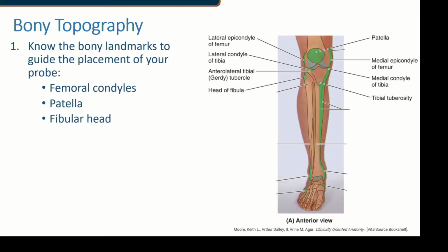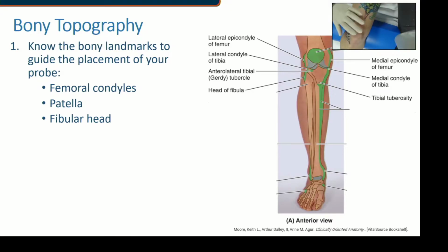And then the fibular head, if you go to the lateral aspects, you can feel the fibular head on the lateral portion of the leg below the kneecap, and actually quite lower than you think. So let me go back to the femoral condyle. If I take my thumb and my index finger, I place it on either side of the patella, I can feel the femoral condyles here. Then of course the patella, we all know what this is, right?